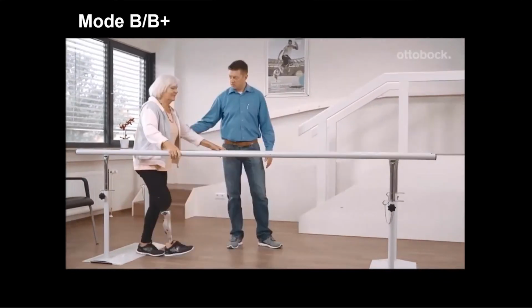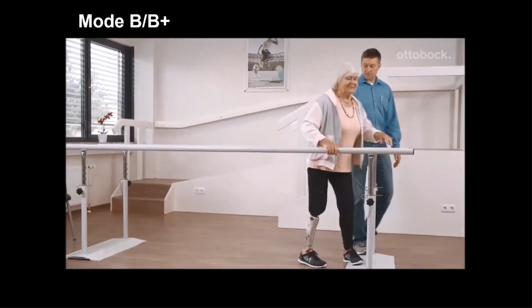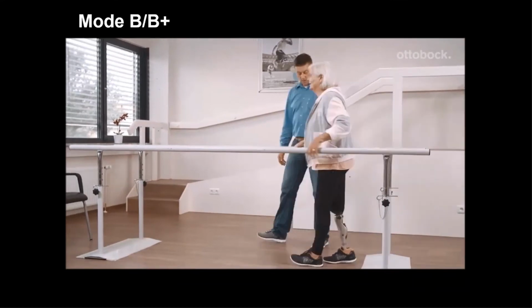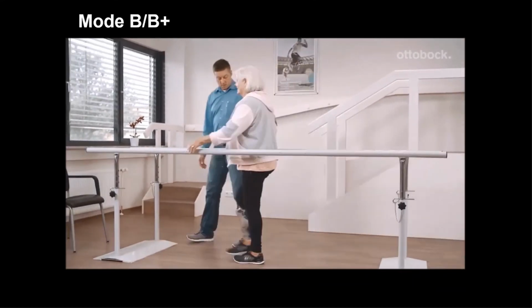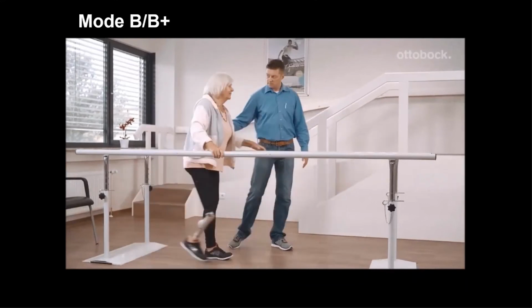So it's not looking for the typical tilting forward, moving forward knee extension moment that the C-leg is looking for, and looking for that on every step. So this is measuring each step individually and then accommodating it for that individual.